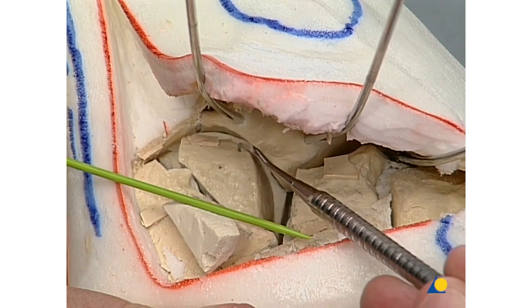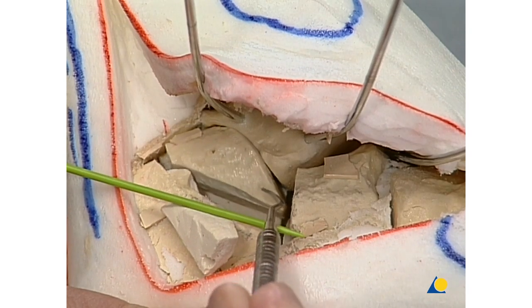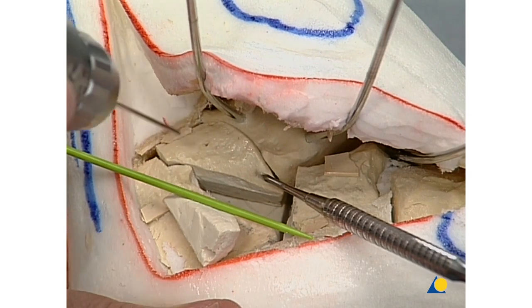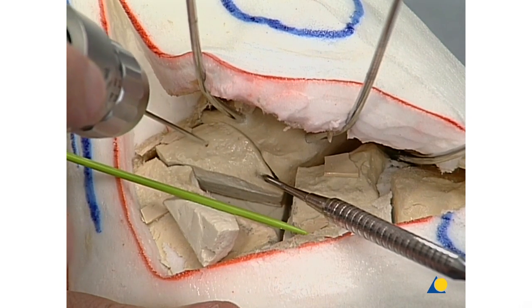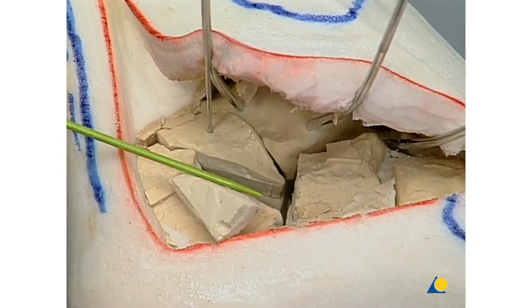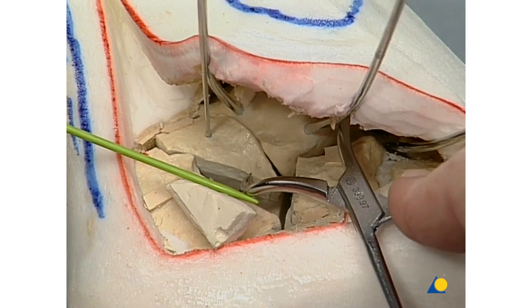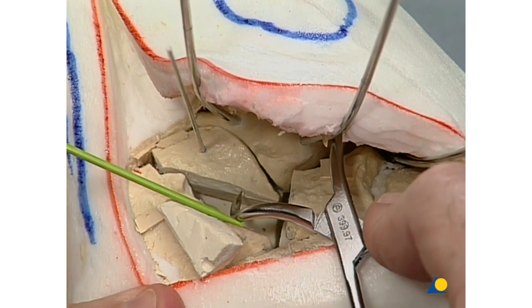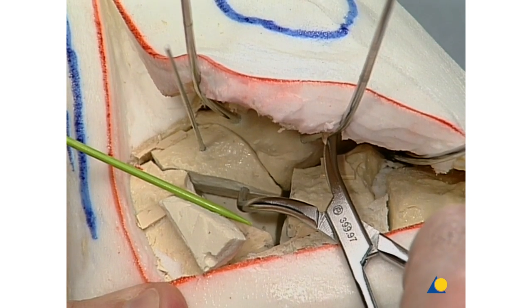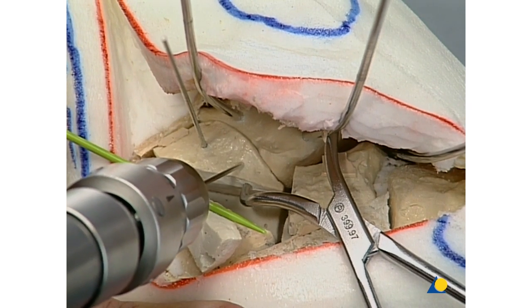Now using the sharp hook, the lateral posterior facet fragment is reduced anatomically onto the medial fragment and fixed to it with one horizontal K-wire. Minute reduction can be completed using the small reduction forceps. A second K-wire secures final reduction.